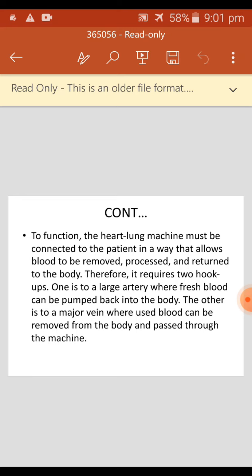Components of the heart-lung machine: HLM basic components. Another one is additional HLM components. Mobile console for mounting multiple pumps. Adjustable mast system for mounting blood pumps. Control and monitoring devices, then display and control panel. Electronic or mechanical gas blender. Anesthetic gas vaporizer. Electronic documentation system.